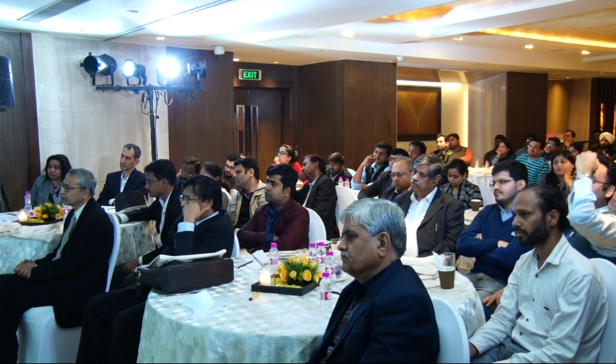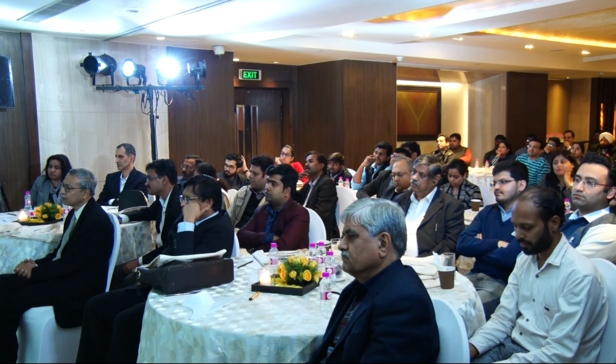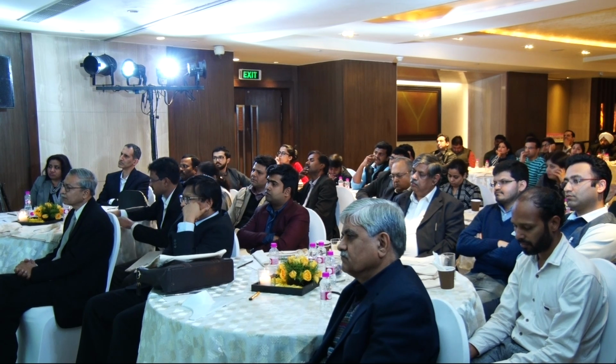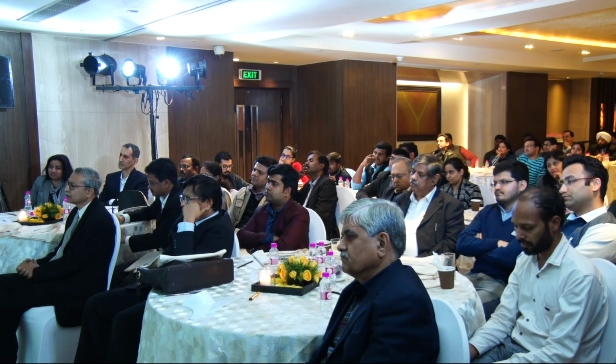If the patient is 100% compliant, the best we can assume is 0.7 of a millimeter at those two couch angles. And that's good to know, because one of the correlations I always tease my therapists with is that it correlates to the mood of the therapist within the control room during delivery. As you approach that 1 millimeter tolerance, the amount of concern on their face goes up.